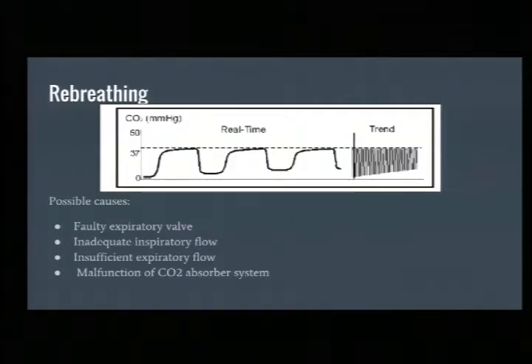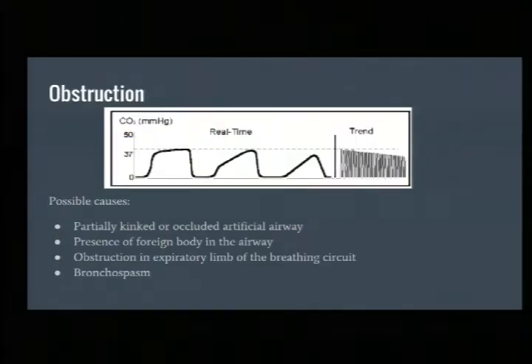So this is what you can start to see, and it'll get more pronounced with this baseline, this A to B that was on the previous slide, elevated more and more and more in a COPDer who's not being allowed to exhale enough or not getting enough exhalation phase out. They stack up, and it's that auto PEEP response. So this is that shark fin look.